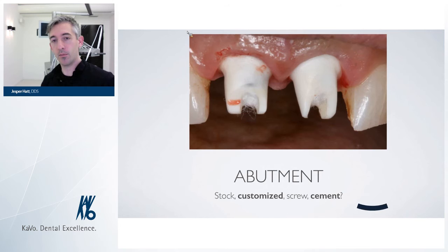And in the beginning, my technician and I wanted to place the proximal margin a little bit subgingivally, as if we had prepped the tooth, because that way we could work the same way we did with a tooth, and we could squeeze the papilla into the right position.